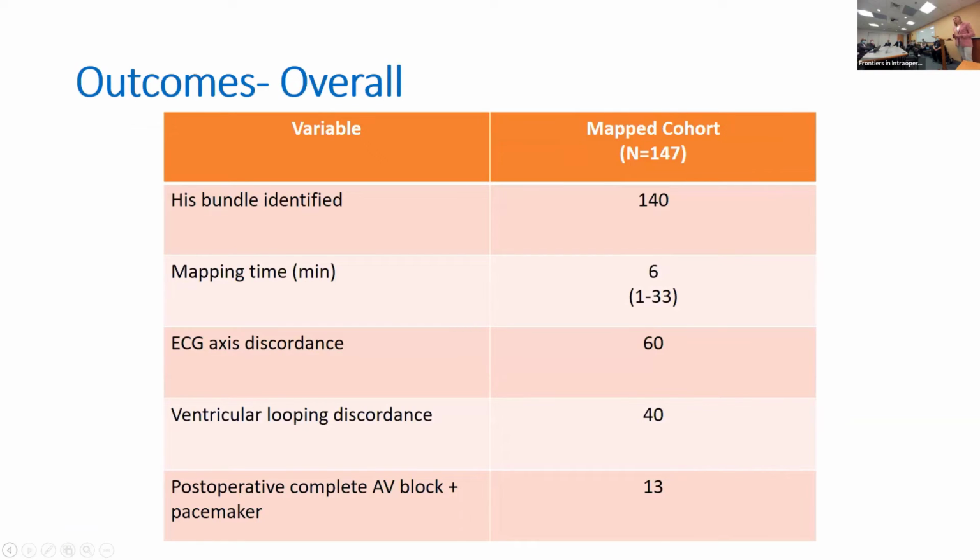And I'd say that checks out with just my practice doing this. It's not much more than that from the time that we defibrillate and start mapping, to the surgeon being completed and moving on to fibrillating back again.